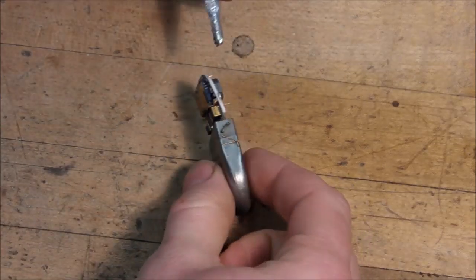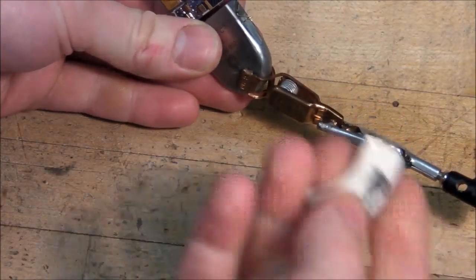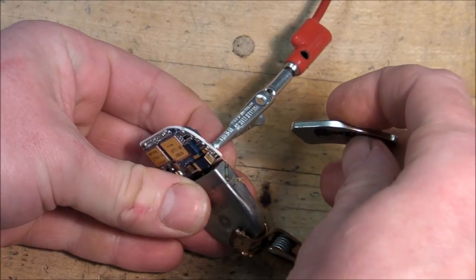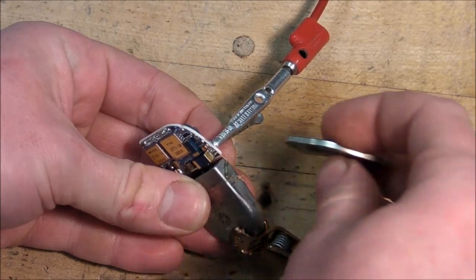Okay, I'm going to hook up that reed switch to the continuity buzzer. I got a nice hard drive magnet here. Doesn't need to be too close. Of course, it's a really strong magnet.